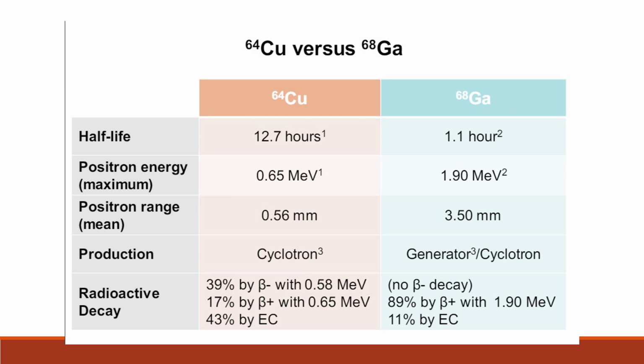You get a lot of electron capture in there, which is also how you're getting more background, right? The electron captured photons might still be picked up. They're still scattering within the patient. They're contributing to stuff even if you're not really seeing them.